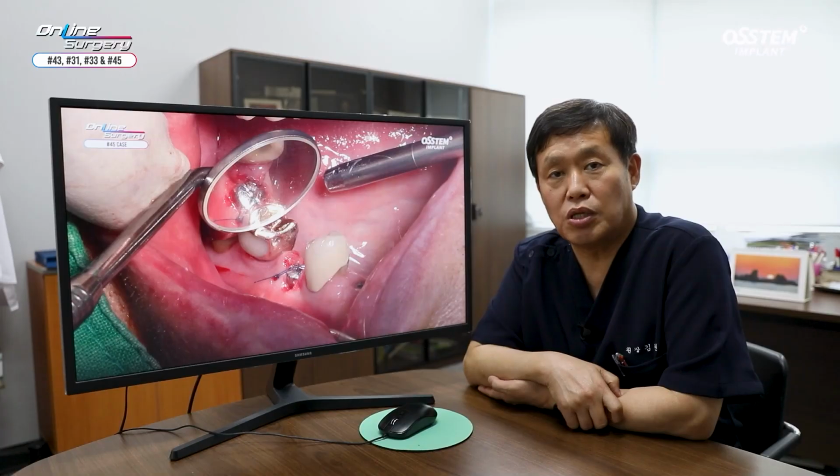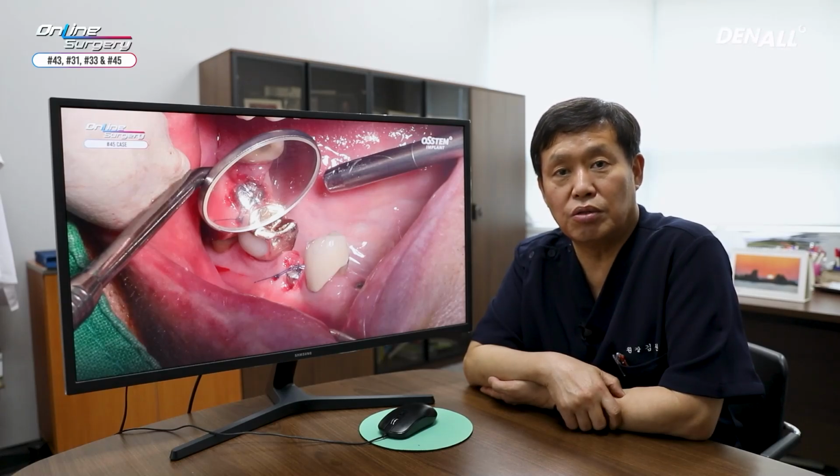Without the use of collagen membrane in an area with a buccal wall defect, immediate implant placement was done using A Oss Collagen. And about 10 months later, if you look at the CT follow-up, the labial wall was nicely maintained.